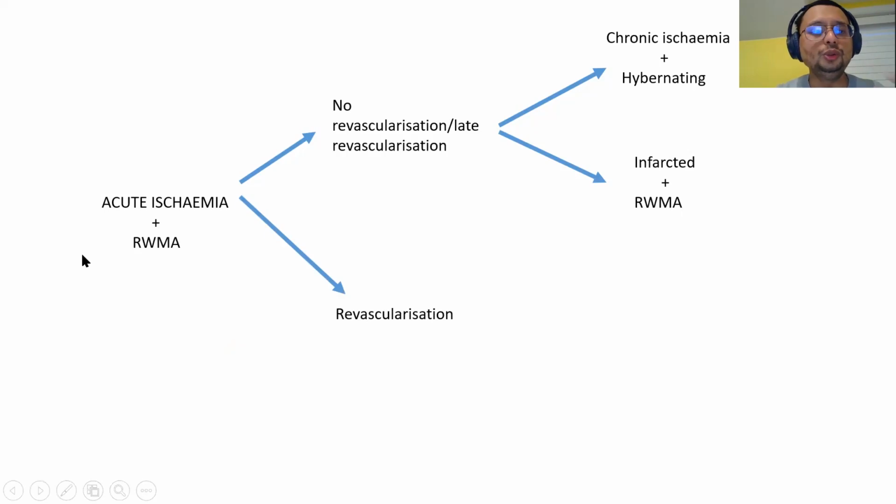However, when you do the echocardiogram, there has not been enough time for the patient to recover their function. So that is stunned. Okay. If you see all these patients with hibernating myocardium, infarcted myocardium or stunned myocardium, their left ventricular wall at rest will be hypokinetic.